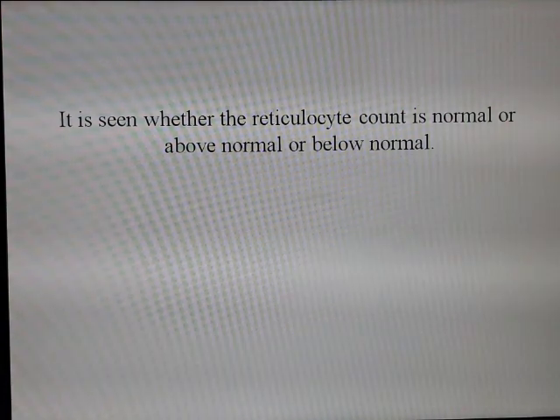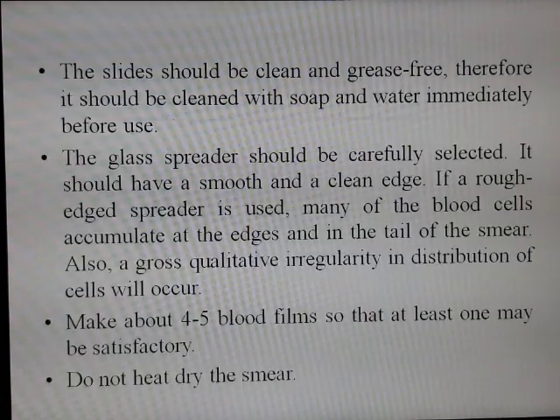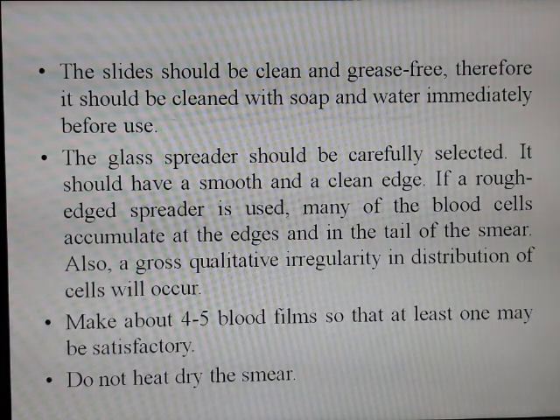So that is the whole thing that we need to see. So the precautions, that is, what are the things that we need to take care of before, during, and after doing the experiment. These are the things: the slides should be clean and grease free. There should be no dust. They should be cleaned with soap and water immediately before use.